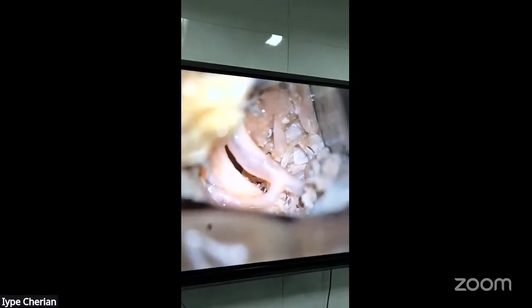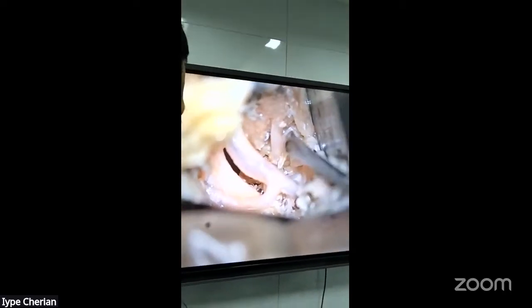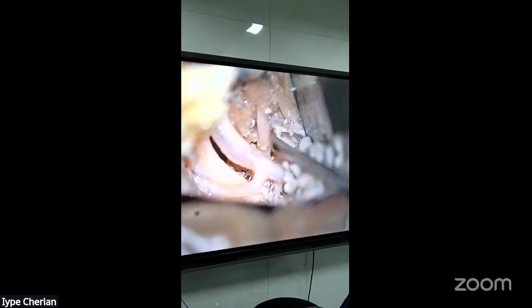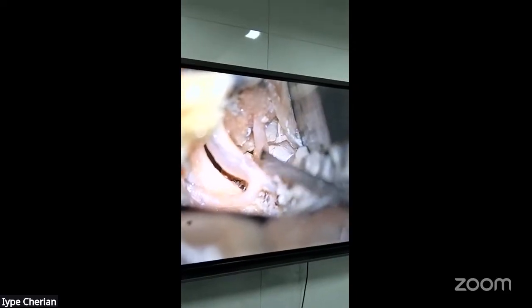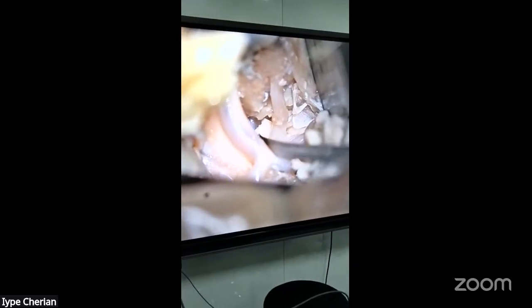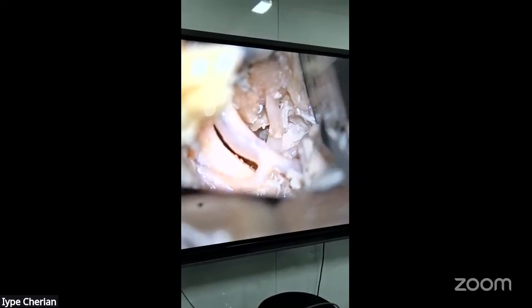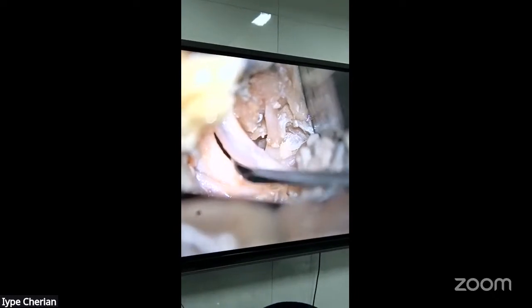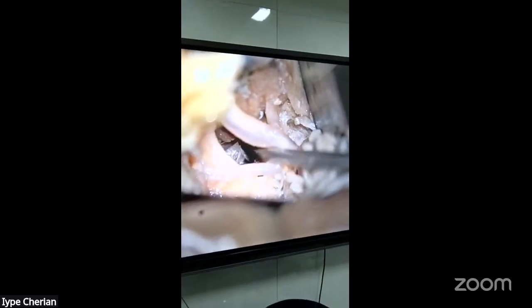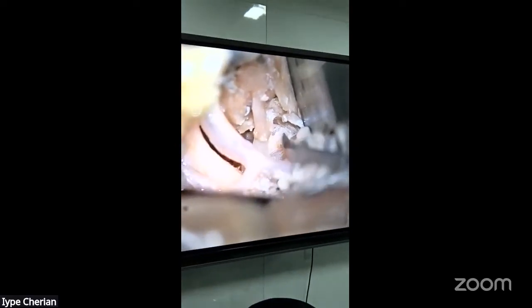This is beautiful. We need to take very nice photos of it. We can describe this approach, the mosaic approach. That is the posterior clinoid process, what you are touching now. We can see the basilar bifurcation. So that's a trans-cavernous exposure. Behind you is the pons. That is the interpeduncular cistern, so we can clip anything from there. Yes, of course. That's the superior cerebellar artery.